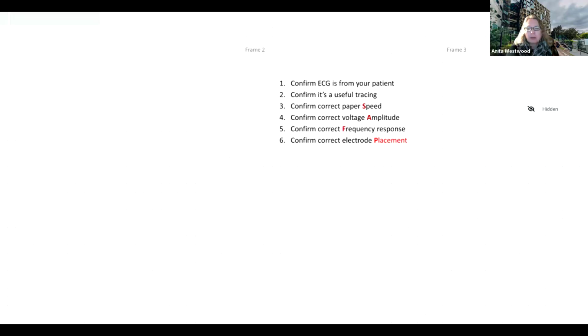You might turn up and that packet of electrodes has been sat in the back of the truck or in the sedan at the back seat there in 40 degrees of Brisbane weather. I can honestly say, Jay, I've never checked the stickers in date, but it's a really good practice, and I think shame on me. It's a great point. In date or functional, sometimes you pull them apart and they just disintegrate. It's like, oh, this one's not too flash. What else are we checking about our electrode placement?